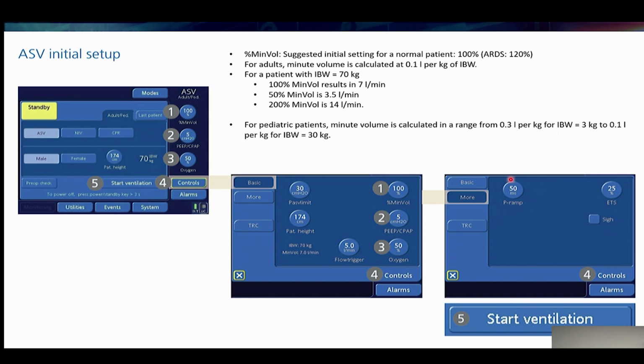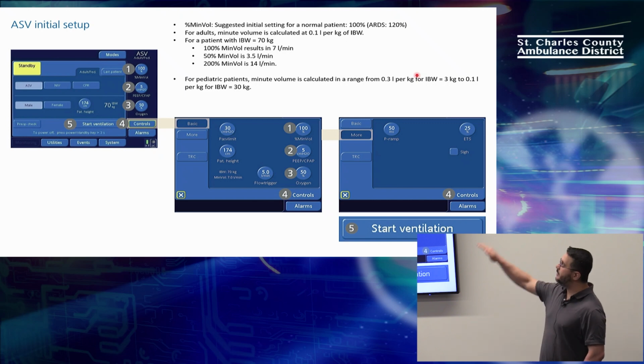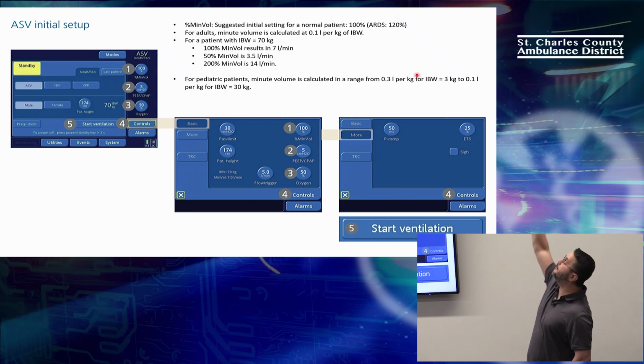Yeah, what does that mean? If I shorten the time, I'm going to give that breath faster. If I increase the ramp, I give the breath as fast as I can. If I lengthen the time, then it gives the breath slower. It's much smoother. So a COPDer might like that fast ramp up into the pressure, shoving the air in faster.